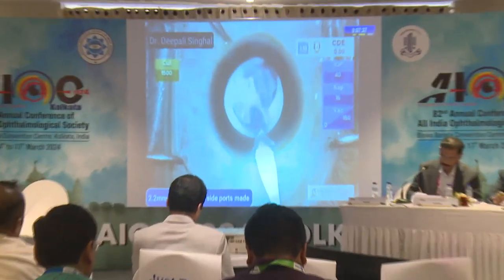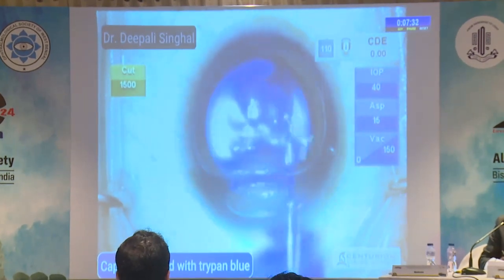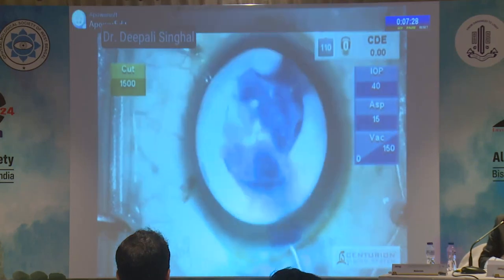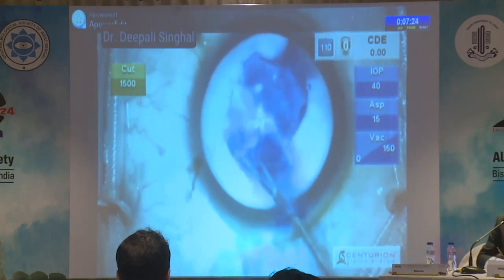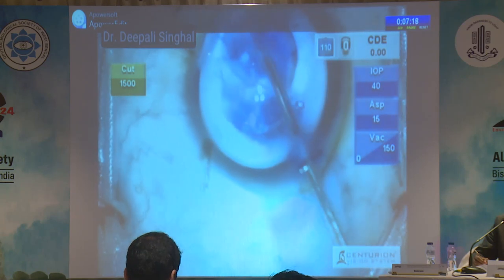First, main port and side ports are made, air and dye injected. Proper staining is ensured since the capsule is calcified and glow is not visible. CCC was started with a capsulotomy needle and micro forceps used to complete the rhexis. Since the capsule was fibrosed, I planned the rhexis circle to go beyond the fibrosed area.